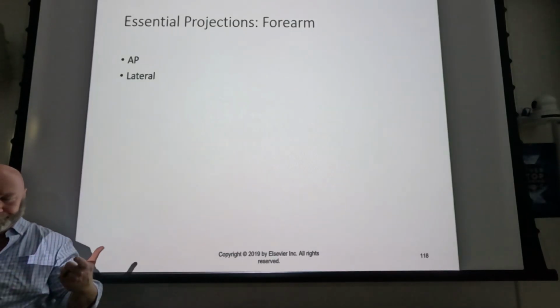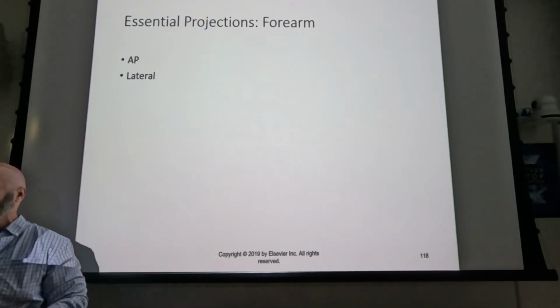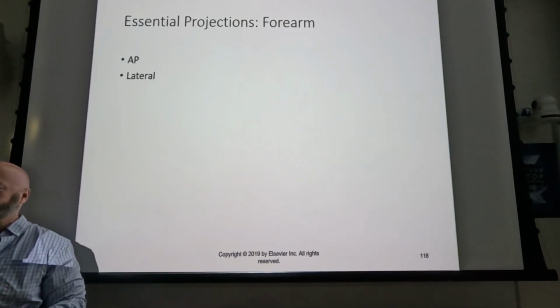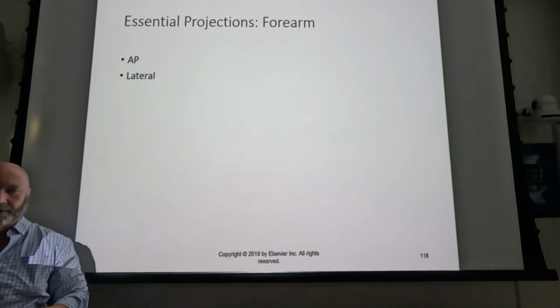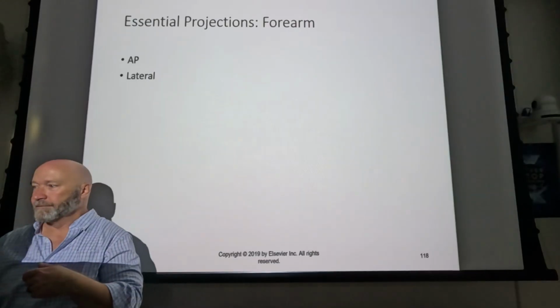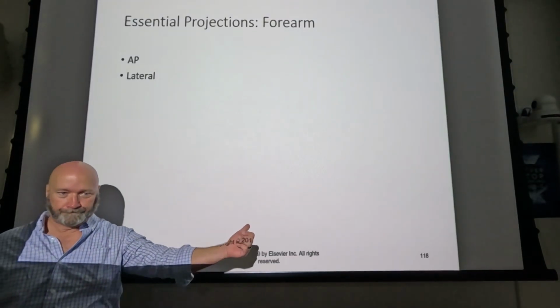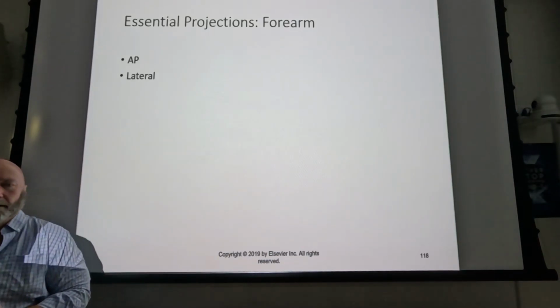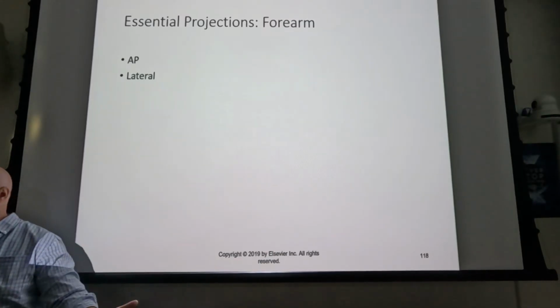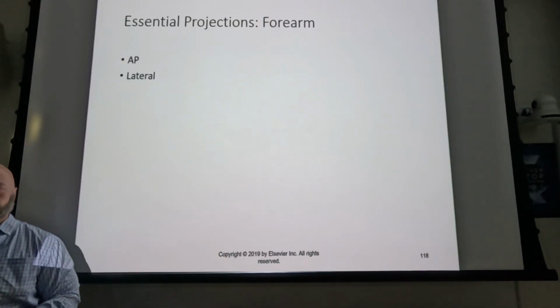So then, once you see the lateral and determine whether or not the patient's got an obvious fracture, you can determine how insistent to be with the patient to get a good AP, right? So if they've broken their olecranon off, how willing are they going to be to just straighten their elbow out like that? Yeah, good luck. And remember, you're not going to force them to do anything. You can suggest, you can try to cheerlead them into it, but it's all up to the patient whether or not they're going to straighten their elbow out.